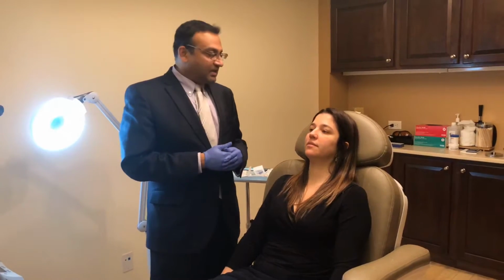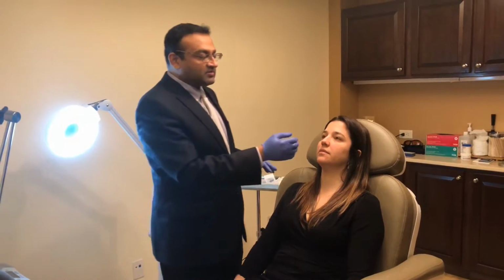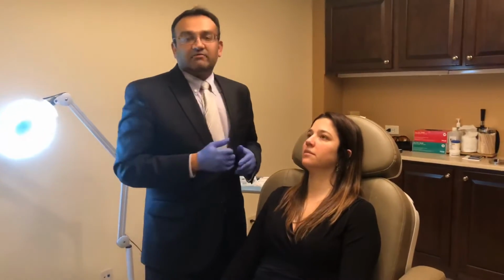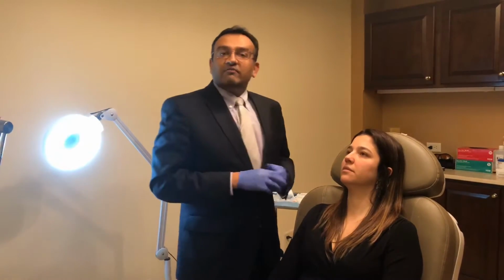This is Veronica. Today we're going to be doing the under eye filler injections and we're going to be treating the tear trough region. Veronica is most concerned with the dark appearance of these tear troughs. Now there are many causes for the tear trough. They could be genetic, they could be aging. Sometimes there's even discoloration or pigmentation, which could be from either the brown discoloration or sometimes vascular leakage from the blood vessels.